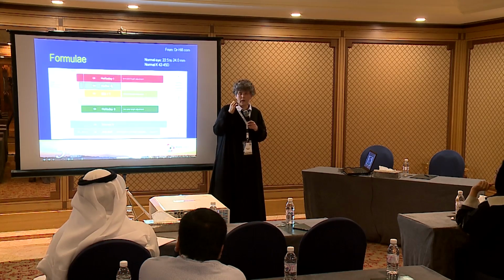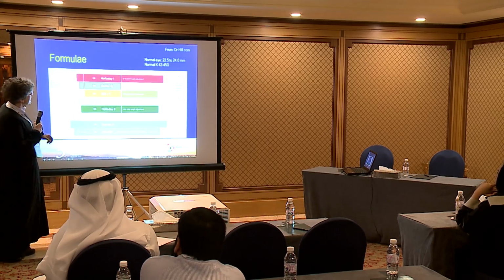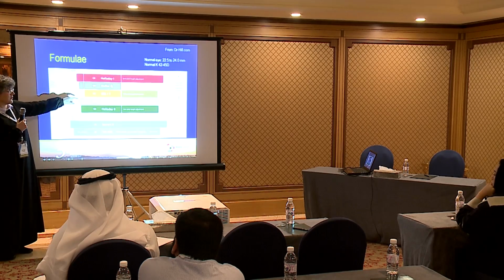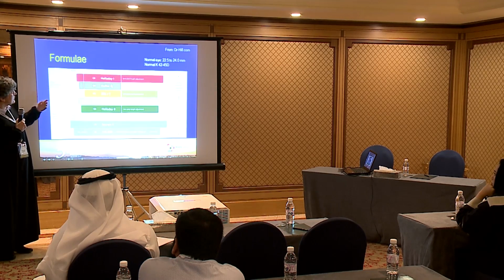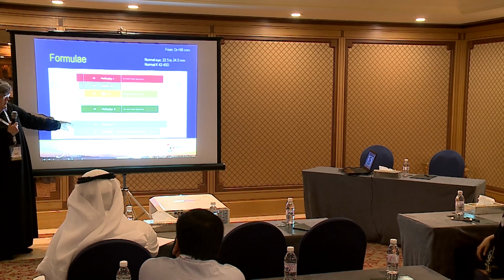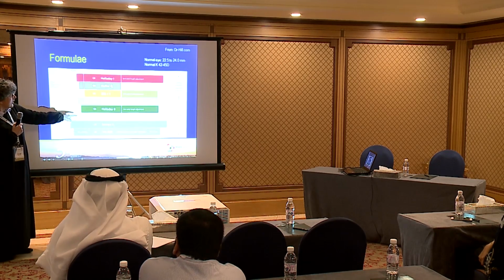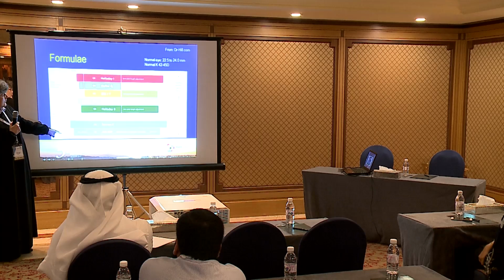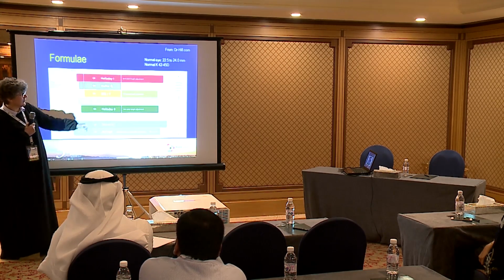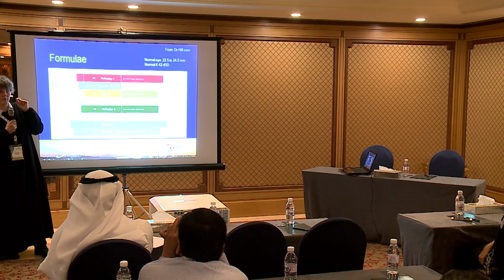The moment the eye is shorter, like here, you will need to adjust. Now, for the moderately short eyes, the Hoffer Q works very well in my hands, in any case. And the newer formulas, which are the Olsen, the Barrett, and the RBF, I'll be talking about that in a few minutes, will have better results. In the longer eyes, you may need to take the newer calculations, and still long eyes are very difficult.